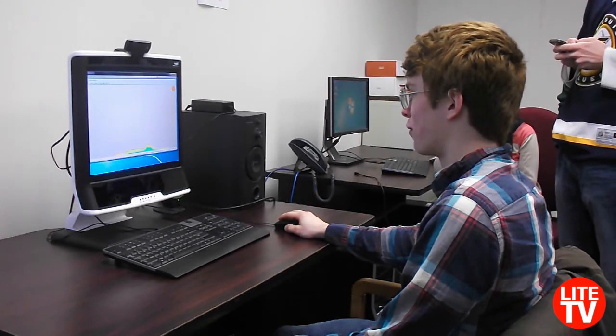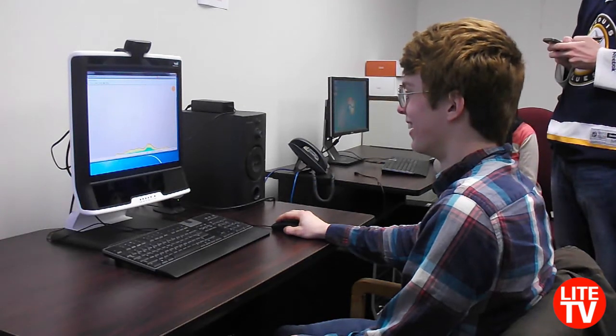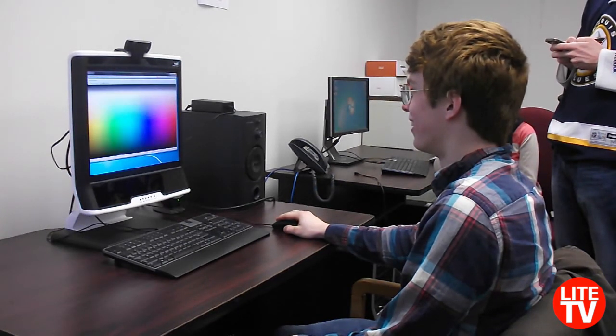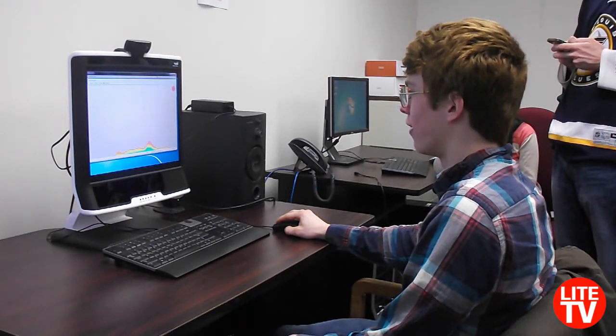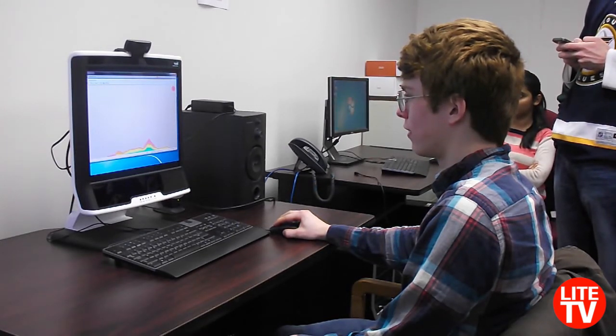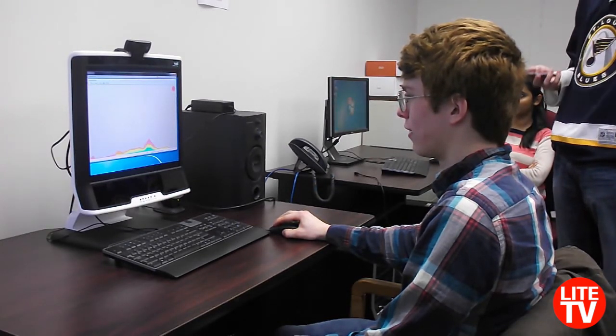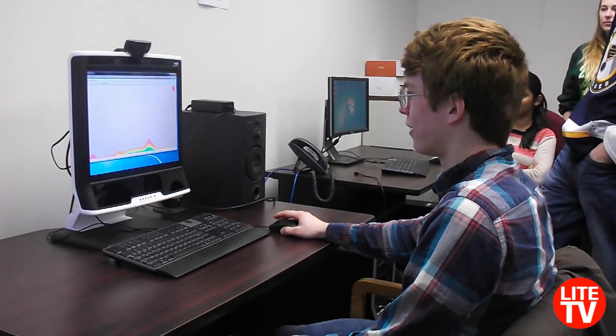Do I have to go until the screen's full? Oh no, you can play with it as long as you want. Have you done this before? No, I haven't. Okay. Do I just close them? That's a nice mount. Press escape when you're done.